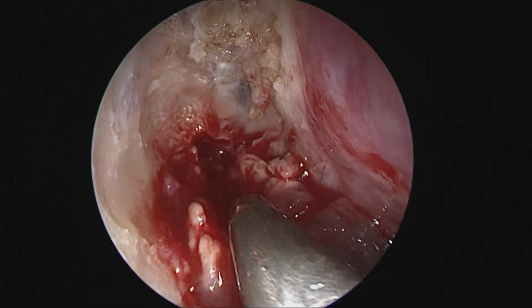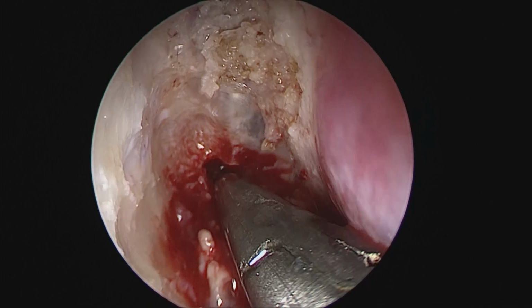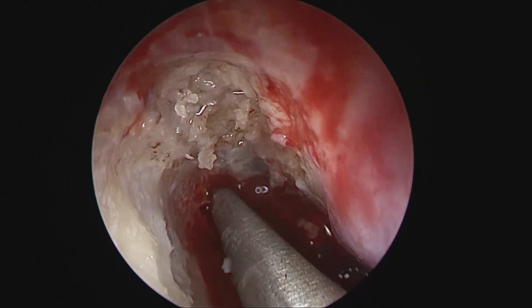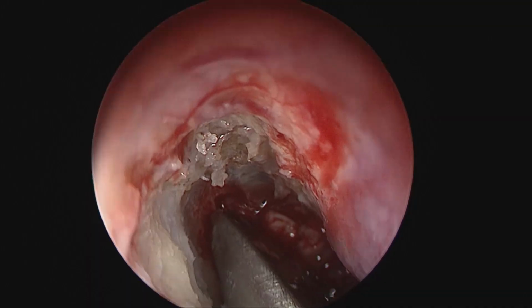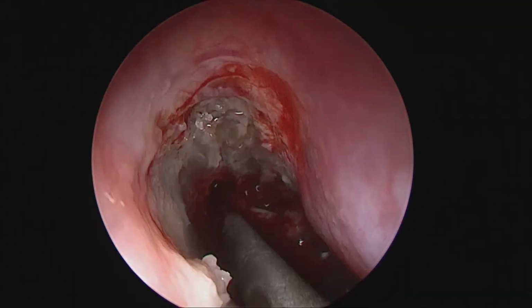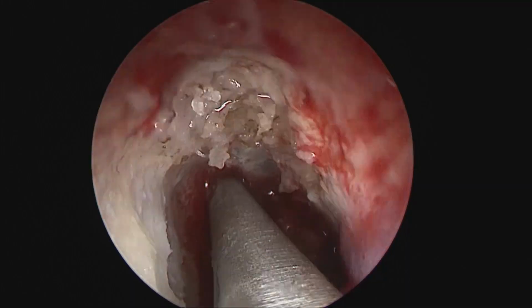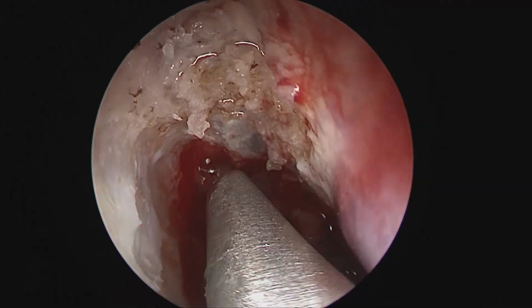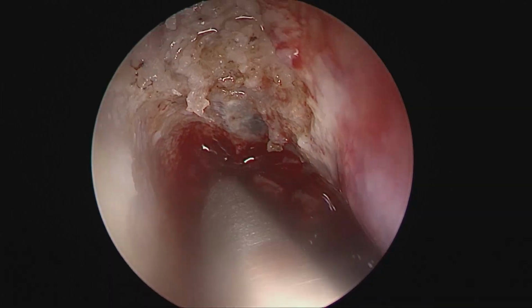So the articulated punch gives us articulating clear bone and then progressively resecting it, thus obviating any fear of actually violating skull base while using a drill here.